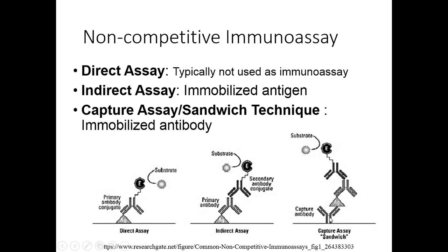We can test for the patient antibody here, and then we have an anti-human antiglobulin. You also have versions of this where you can have just the capture antibody and the patient antigen, and it looks more like this, where you don't have this secondary thing here. But in this sandwich, this is going to be the patient antibody and this is going to be an antigen. And we go from there. So that's a sandwich. We're going to talk more about sandwiches in a few minutes. So we'll take a look at that shortly. This really isn't equivalent to sample B there. We're going to talk about that when we talk about sandwich assays.